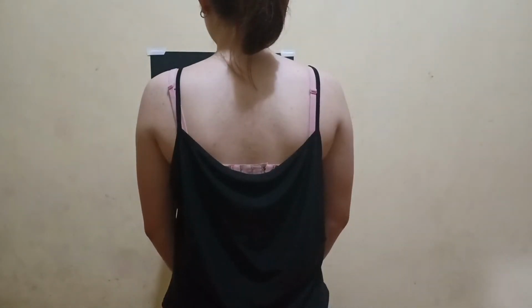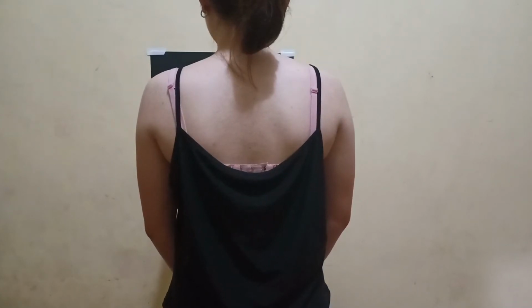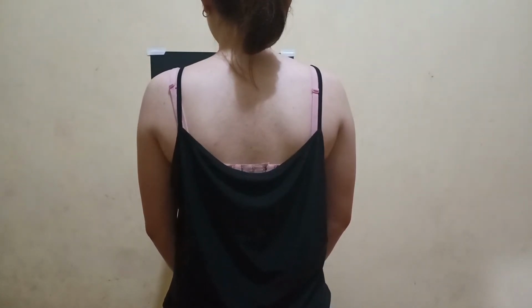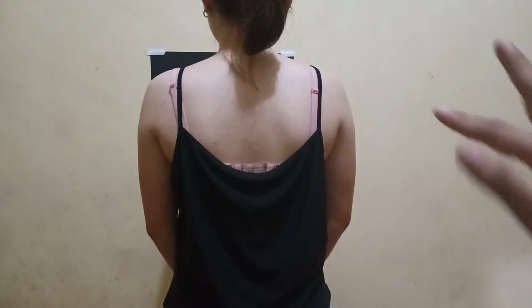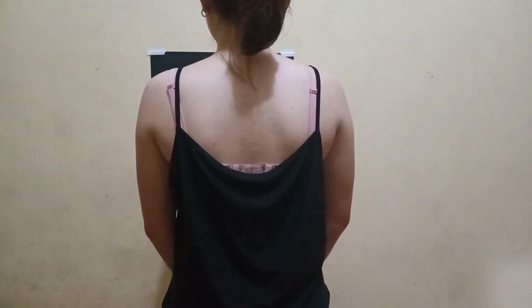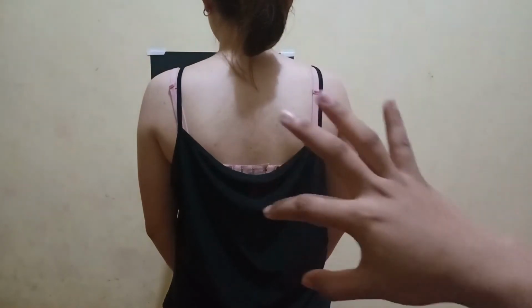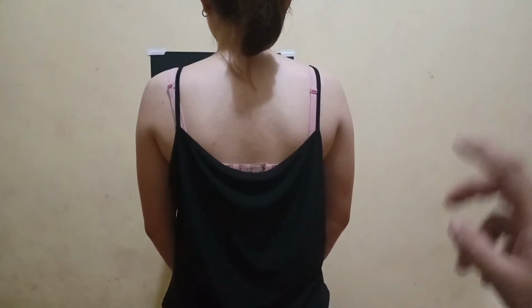Because of these differences among patients, the amount of body obliquity may range from 45 to 60 degrees. Center the scapulohumeral joint to the central ray and to the center of the image receptor. Then abduct the arm slightly so as not to superimpose the proximal humerus over the ribs. Do not attempt to rotate the arm.